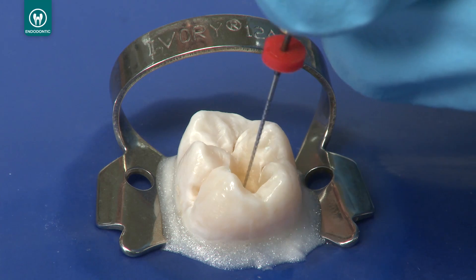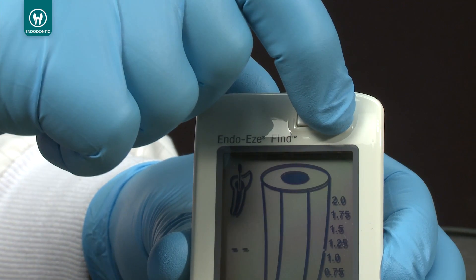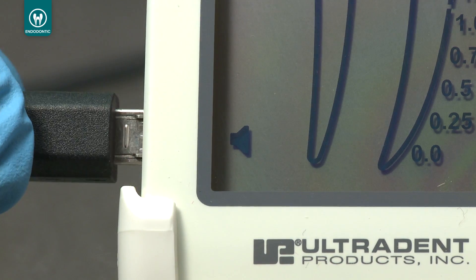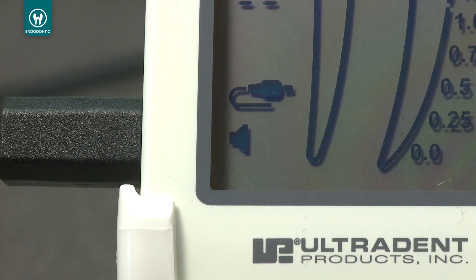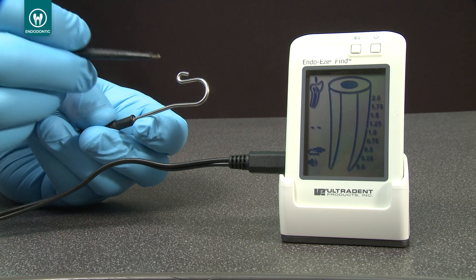Depending on the size of the canal, insert a number 15 hand K file or another appropriate file into the canal. Now get ready to perform the electronic measurement by turning the apex locator on. Plug the measurement cable into the left side of the device and make sure that the cable icon appears on the bottom left corner of the display. Plug the file clip and the lip clip into the measuring cable.